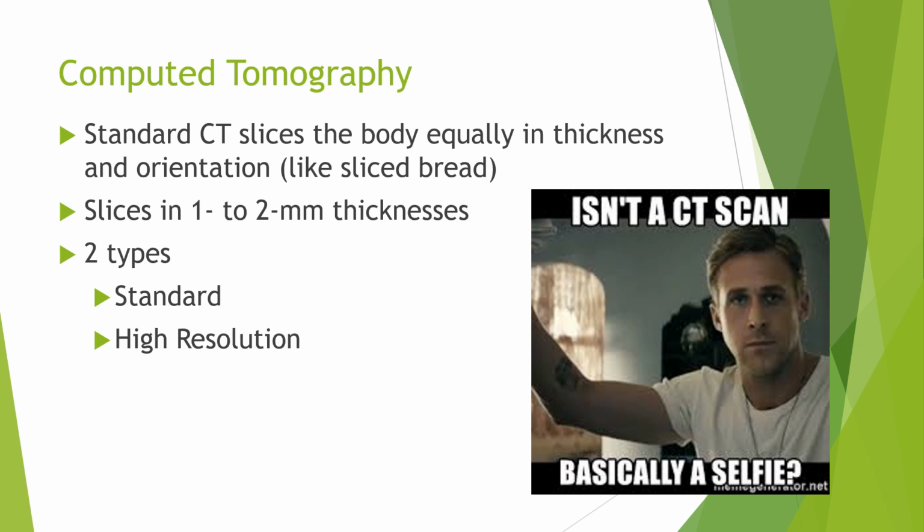However, this might be more historical at this point because most of them are now coming to the point where they're almost all high resolution. So we'll go over a little bit about the difference between standard and high resolution. However, just understand the technology is getting better and better as we're recording this, and you'll probably see mostly high-res CT scans out there.